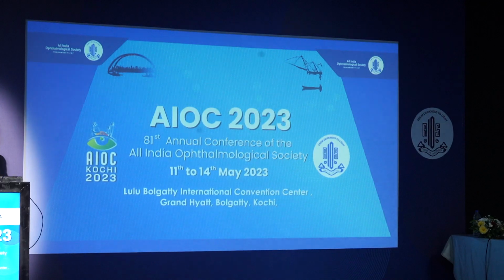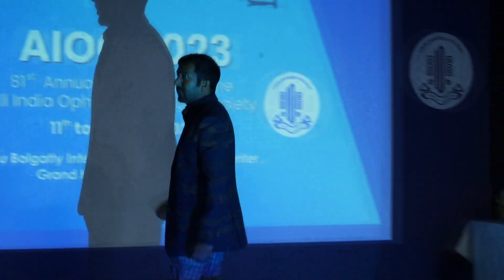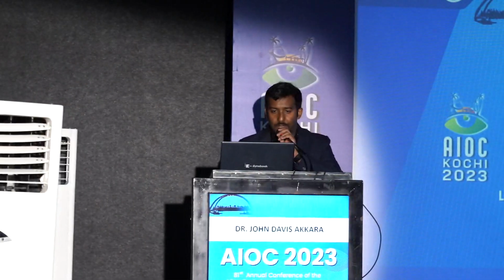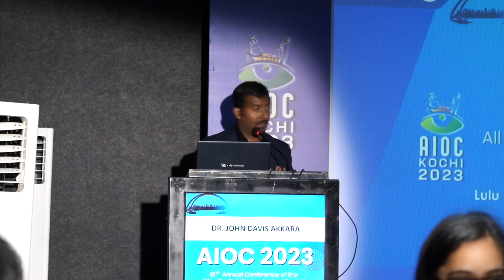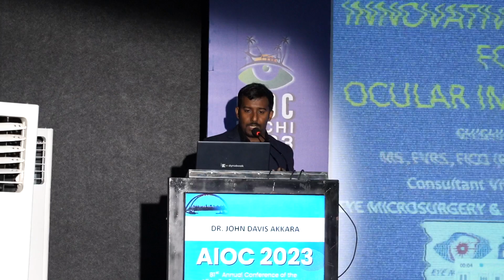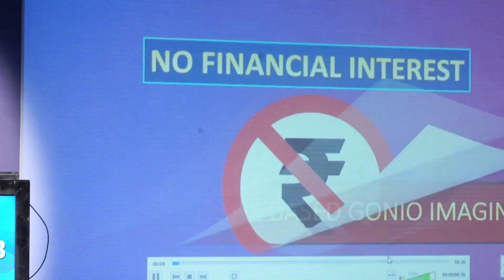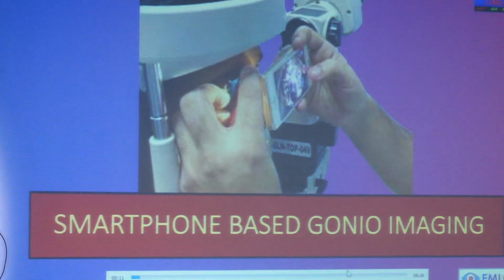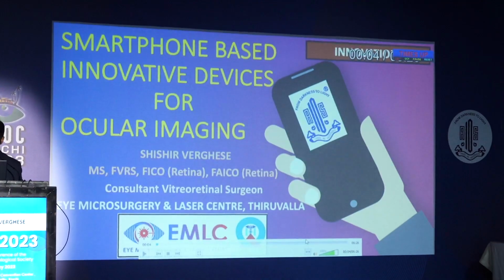I would like to play Dr. Shishir's video. He has a little bit of a clash of commitments. So next is Dr. Shishir Verghese. He's going to have a presentation on smartphone-based innovative devices for ocular imaging. Let me just get the audio also fixed.